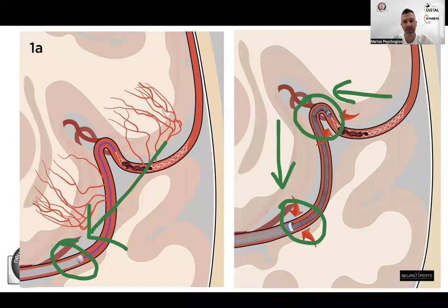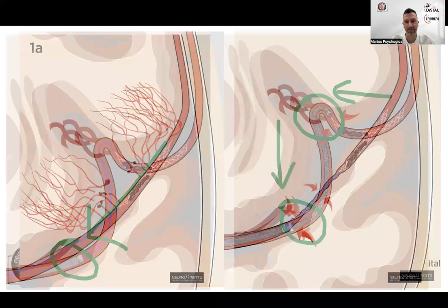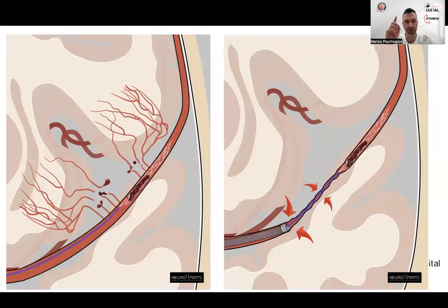So what we do is that we try to produce more stable points, and then we minimize the forces, as you can see here. So we retract the stent retriever within the tip of the aspiration catheter, and then we retract the whole unit, stent retriever, clot, and small aspiration catheter, towards the big aspiration catheter. And the tips of the aspiration catheters are working like stable points for our forces to be applied. So this is problem number 2.